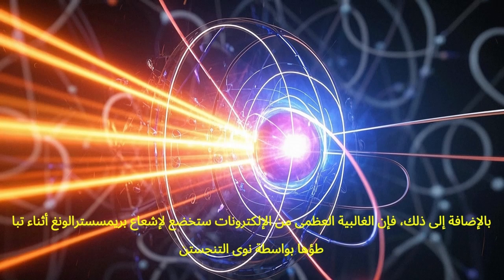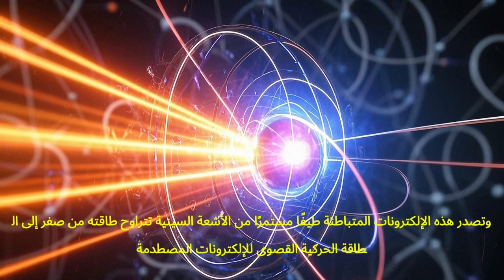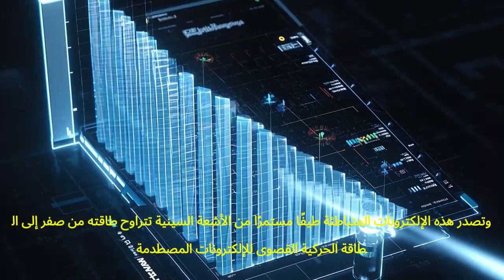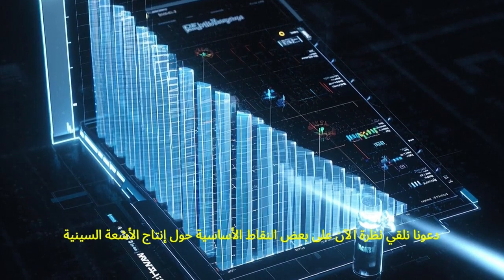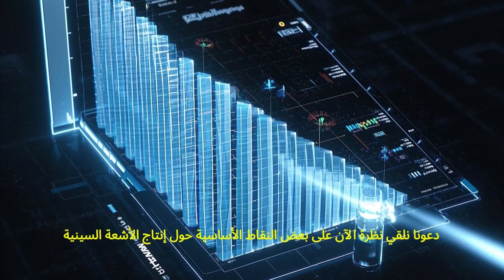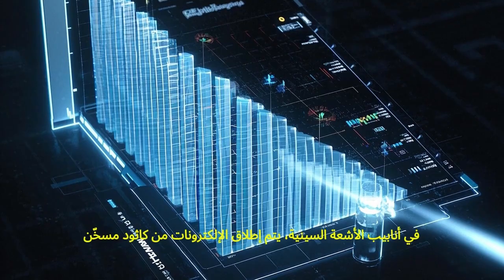Additionally, the majority of the electrons will undergo Bremsstrahlung radiation as they are decelerated by the tungsten nuclei. These decelerating electrons emit a continuous spectrum of X-rays. The energy of these X-rays ranges from a minimum of 0 up to the kinetic energy of the incident electrons.